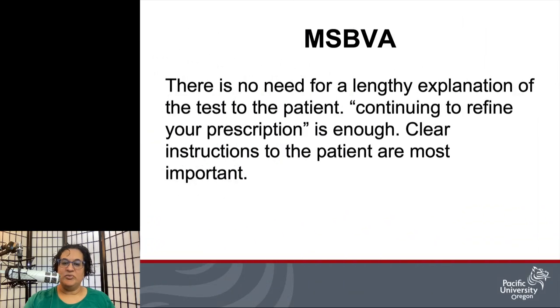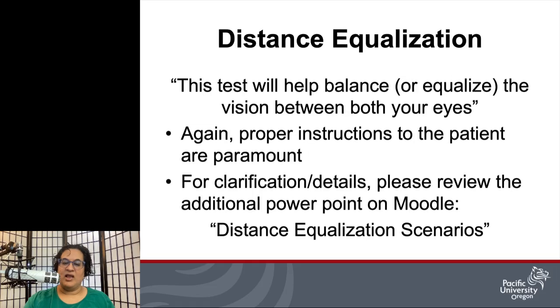After JCC, you'll put in your second 2040 blur and then clear up the vision again for your patient. Get them to the point where they can see 1 or 2 letters on that 2020 line, and then go ahead with your forced choice. After MSBVA, you'll put in your third 2040 blur, and remember you can use the same 2040 blur values that you used for your second one, and go ahead and use prism to dissociate the images that the patient sees with each eye. From this point on, your patient will have both their eyes open.